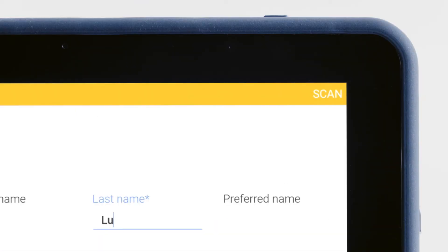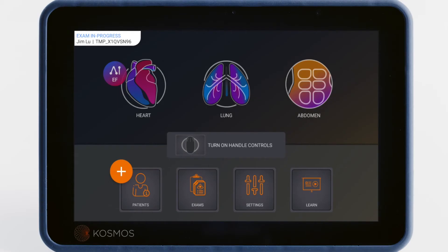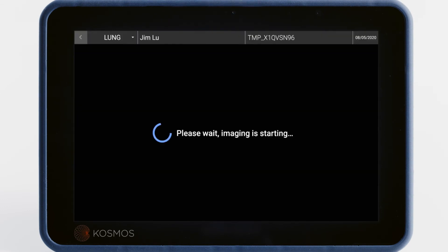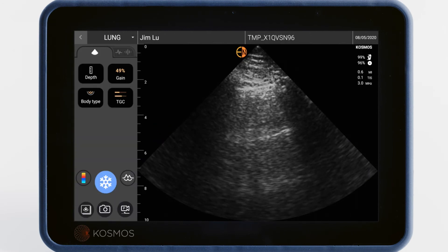Tap on the Scan button on the top right to select either the EF button or an ultrasound preset and begin scanning. We'll be scanning the lungs, so we'll tap the Lungs icon. As you capture images and videos, they will be saved to the patient exam.